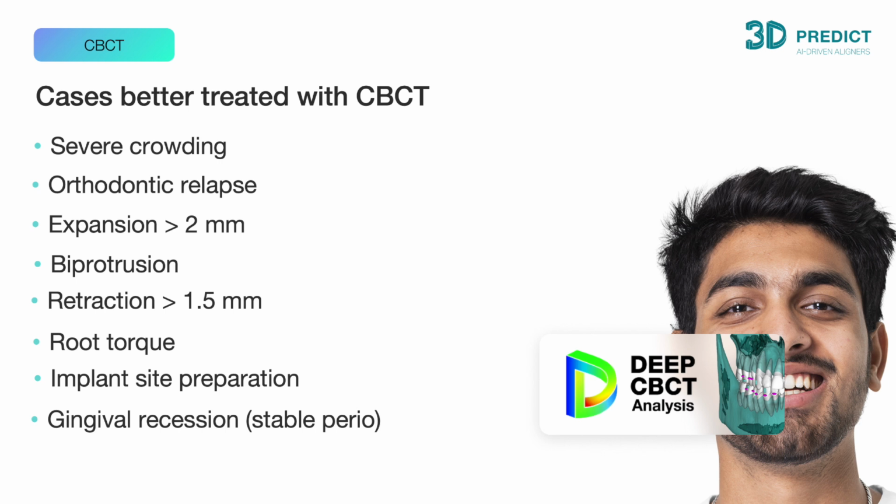This is a list that will help you decide when to submit a CBCT with your case. As a rule of thumb, when you're foreseeing that a lot of movement will be needed to resolve the case, in other words, for any complex cases, a CBCT is recommended. Let's quickly go over each bullet.